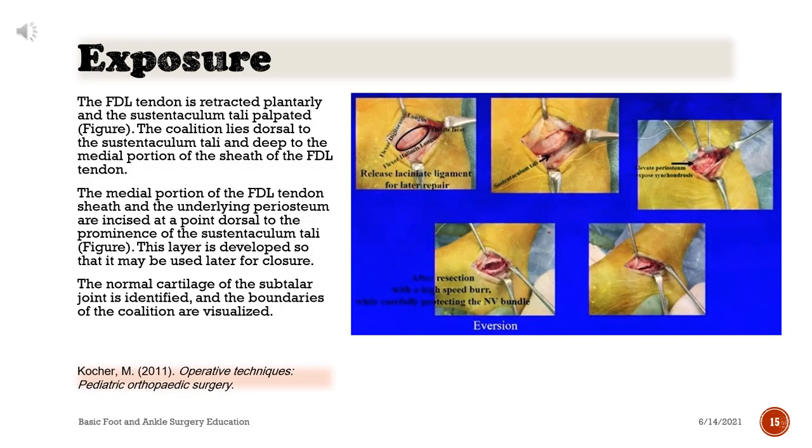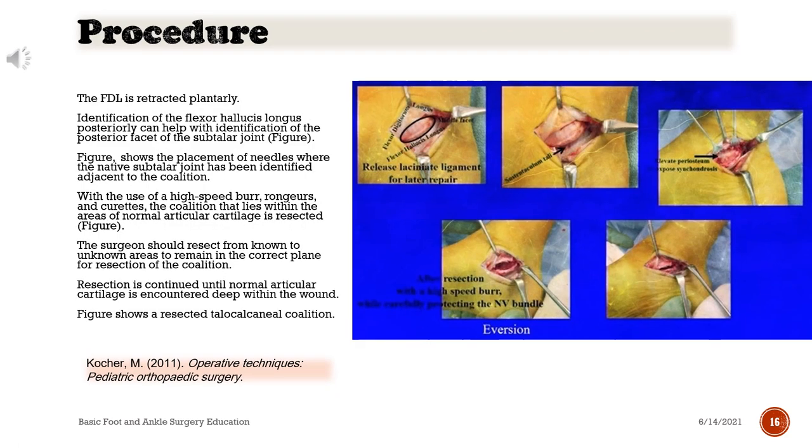The FDL tendon is retracted plantarly and the sustentaculum tali palpated. The coalition lies dorsal to the sustentaculum tali and deep to the medial portion of the sheath of the FDL tendon. The medial portion of the FDL tendon sheath and the underlying periosteum are incised at a point dorsal to the prominence of the sustentaculum tali. This layer is developed so that it may be used later for closure. The normal cartilage of the subtalar joint is identified and the boundaries of the coalition are visualized. The FDL is retracted plantarly. Identification of the flexor hallucis longus (FHL) posteriorly can help with identification of the posterior facet of the subtalar joint. Needles are placed where the native subtalar joint has been identified adjacent to the coalition.